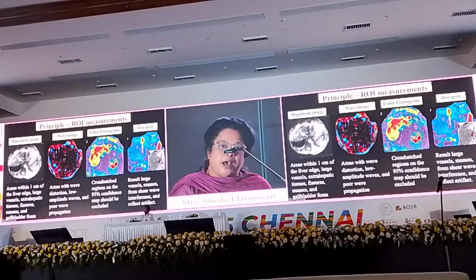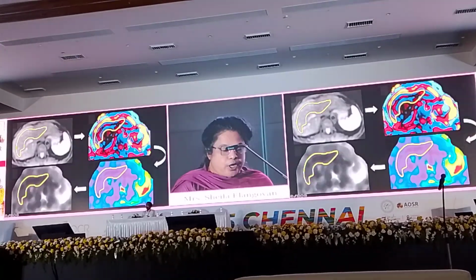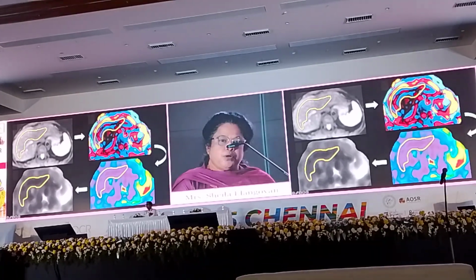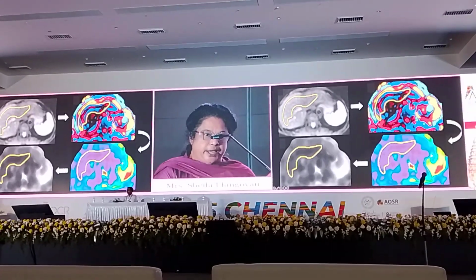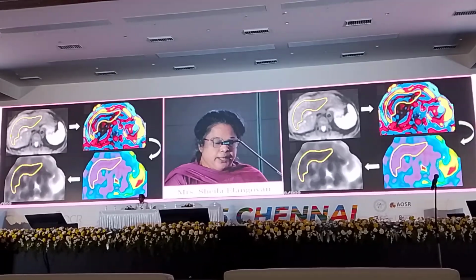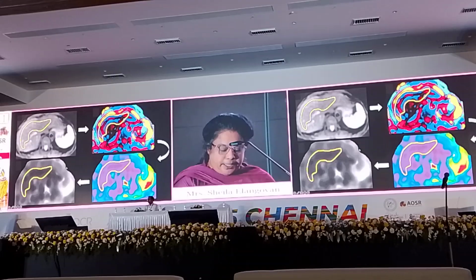So you need to look at other grayscale images like T2 weighted images before you avoid the hotspots. So for example, this is your first set of magnitude images. You can either go for manual measurements or automated measurements. A freehand ROI tool will be easier. Just trace the areas where you need to quantify. Copy and paste it on your wave image, then copy and paste it onto your color and grayscale elastograms and then quantify.